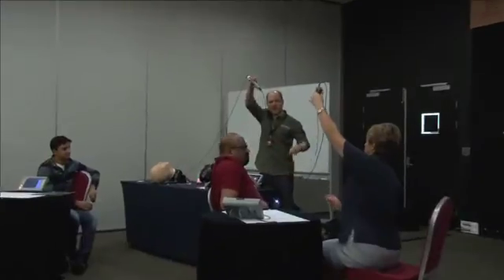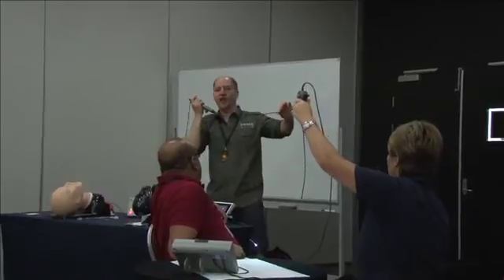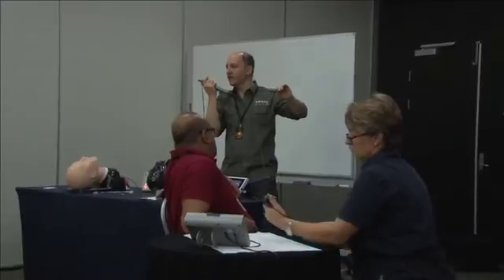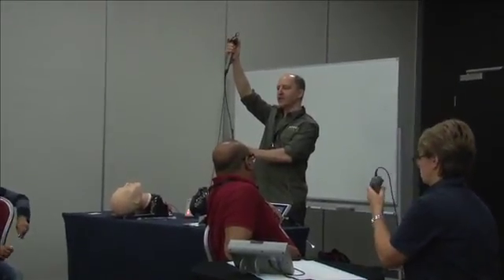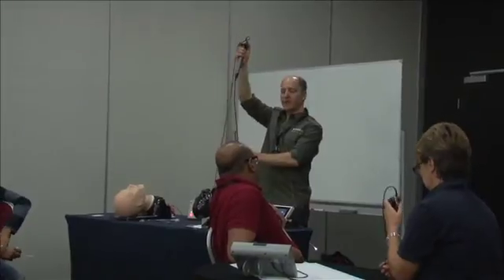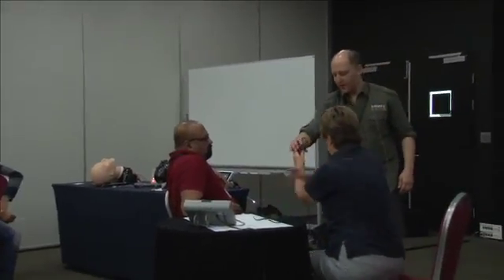We are using a short rhinolaryngoscope — notice this one is 30 centimeters and this one is 60. It takes a lot more skill to work at full length. As a general principle, you want the scope straight — if you kink it you can't articulate the distal tip. When you transmit movement you do it much better with a straight scope. For intubation with a long scope I call it the Statue of Liberty — you have to keep your arm up. Even with short scopes, keep it straight.